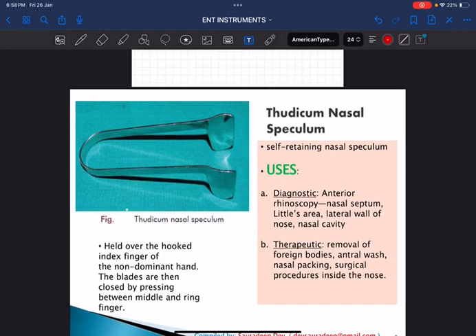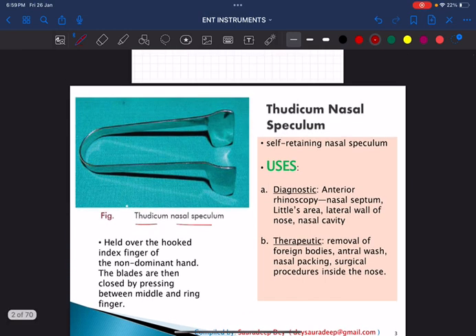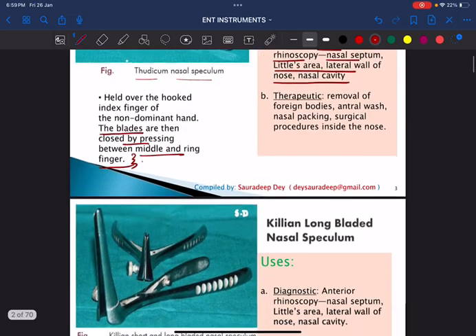The first instrument is called the Thudicum nasal speculum. It is the only and most commonly used nasal speculum for nasal cavity examination. It is used mainly for anterior rhinoscopy — examining the nasal septum, lateral wall of the nose, and Little's area where Kiesselbach's plexus is located. It is a self-retaining nasal speculum. It must be held over the hooked index finger of the non-dominant hand, with the blades closed between the middle and ring finger.